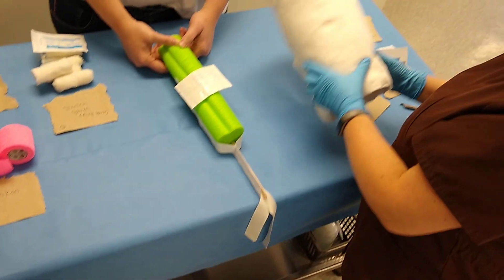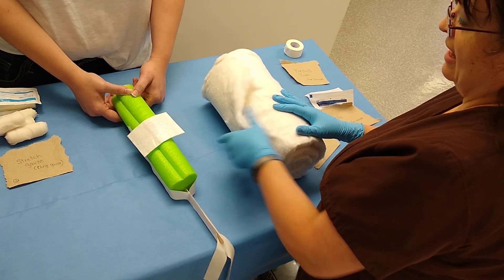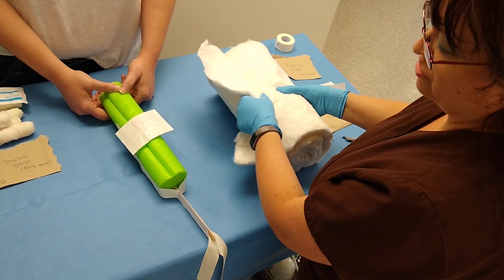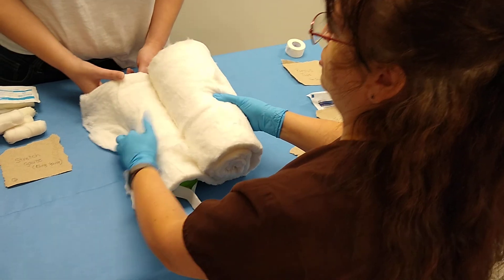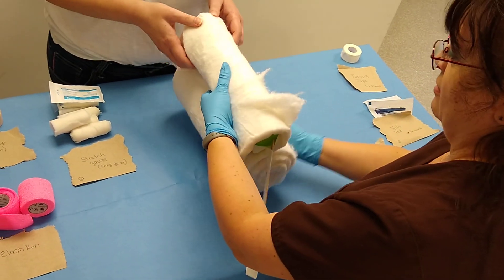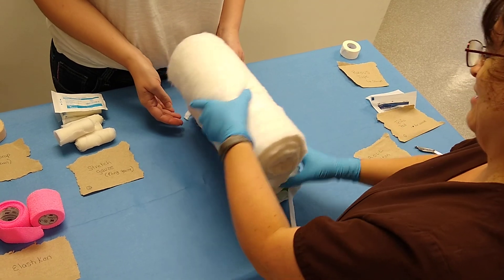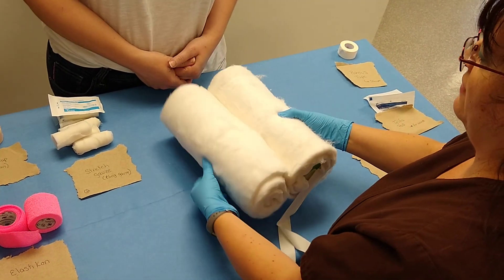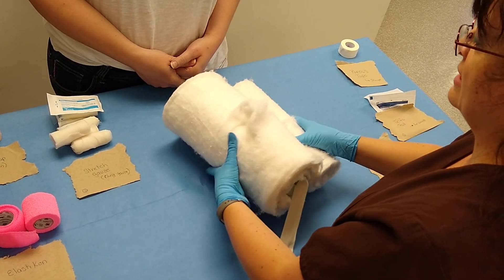At this point we're going to want to add padding. This is called roll cotton. It's meant to add a lot of bulk and cushion without cutting off circulation to your patient. You're going to unroll it just around your patient's leg. You want it to be very thick. You want to use it to immobilize the leg.